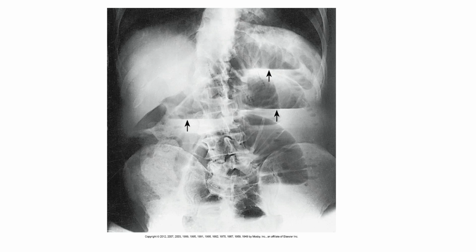Okay? Sometimes patients don't have air bubbles in their bowels for whatever reason, and there's not an appreciable amount of air fluid level signs. The meniscus sign is not as dominant as it is in this radiograph. And so sometimes the radiologists do need the label.